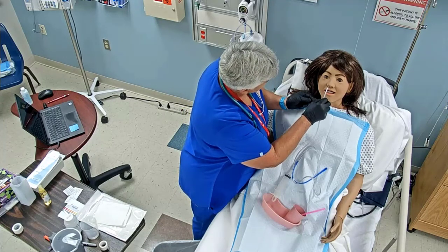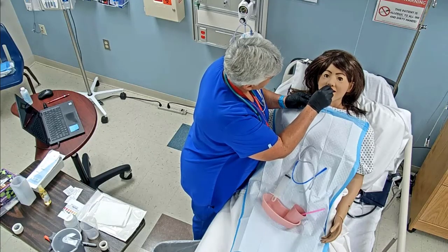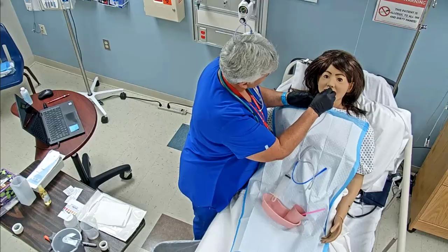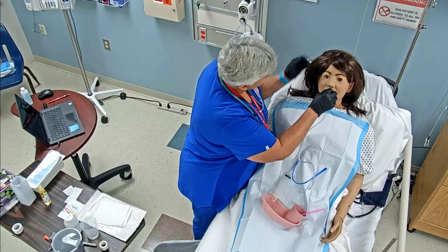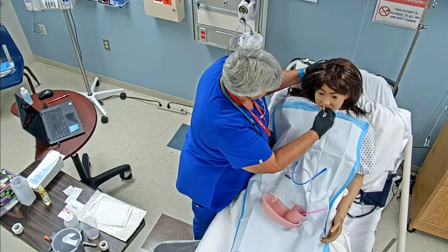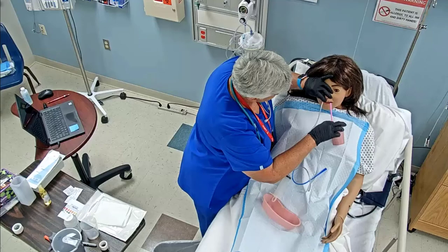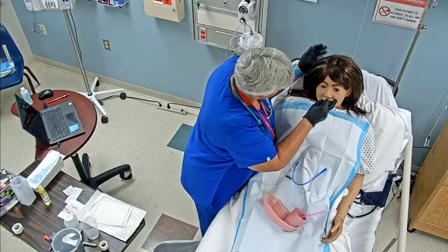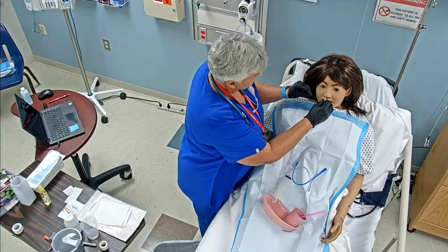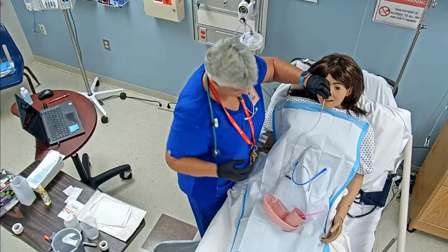Okay, and then as we get back to the pharynx, you may feel a little tickling and gagging or coughing. Okay, and so we're going to wait just a minute. So once we get there, I had your head back on the pillow. Now I'm going to have you put your chin to your chest, and take some sips of water. And every time you have a sip of water and you swallow, I'm going to advance this. Now, note that if the gagging and the coughing is persistent and it doesn't stop, then we're going to stop.